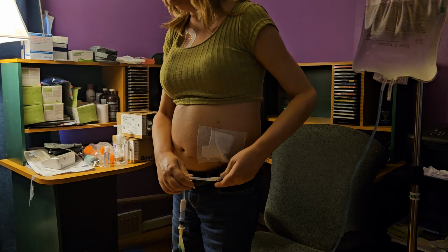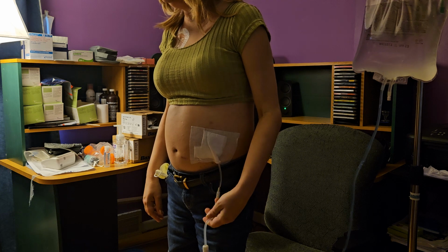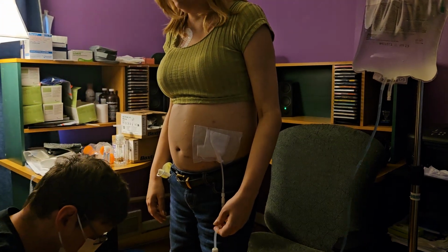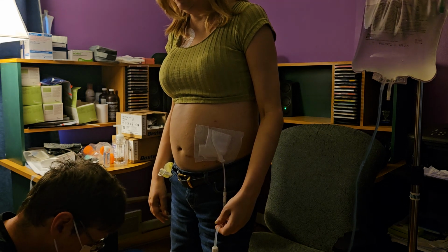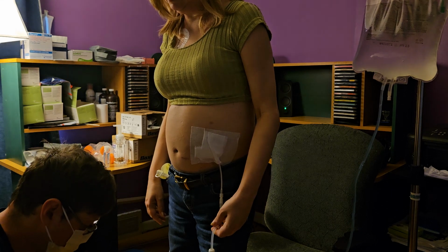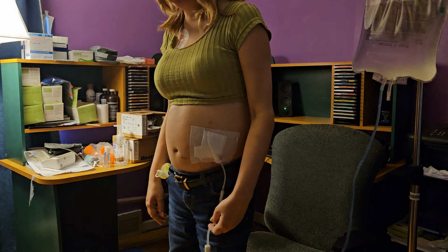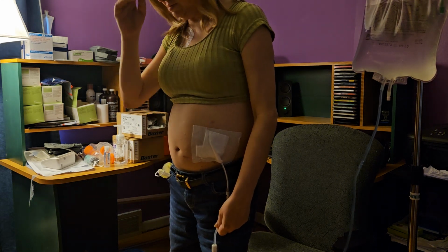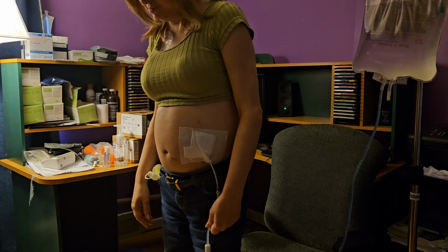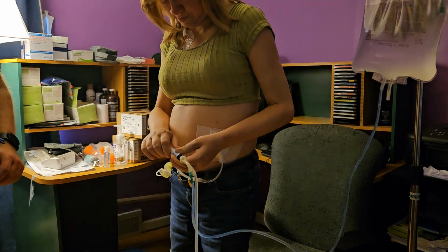It feels colder. It's been 15 minutes. Still draining? That's good. You can close that? A little bit. Close the roller clamp. Close the roller clamp. Now it's done.